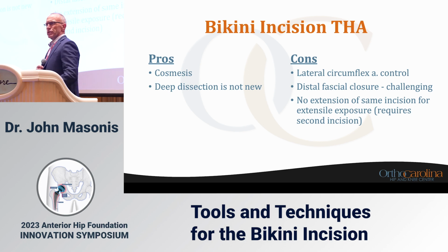So you just need to learn the dissection from the skin to the level of the fascia and make sure you've mobilized this well. The cons are this: lateral circumflex artery control. That's one of the issues.